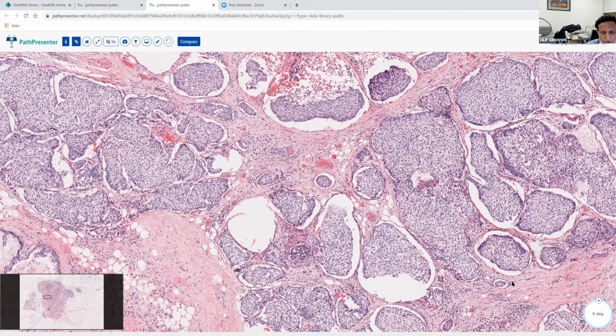So three-dimensionally speaking, there is a chance that you may not be able to demonstrate any myoepithelial layer in the portrait that you are looking at of an encapsulated papillary carcinoma. So mere inability to see those myoepithelial cells does not mean that this is an invasive carcinoma.